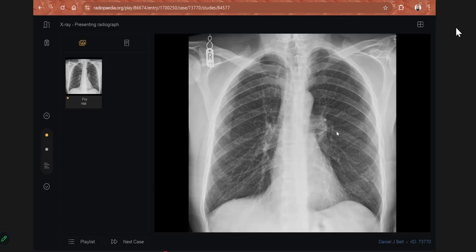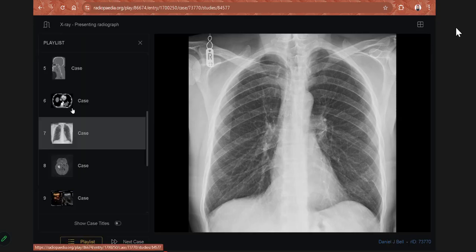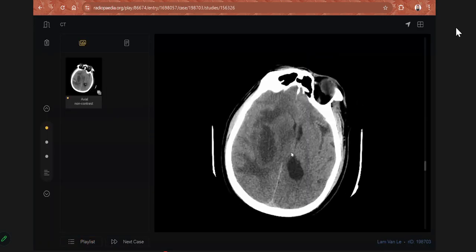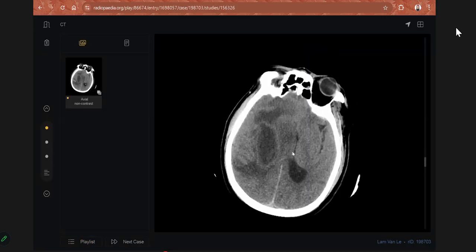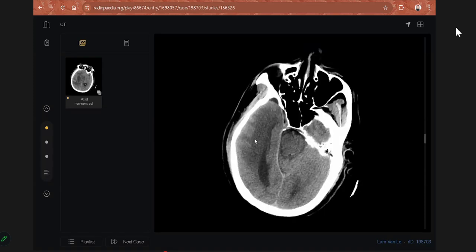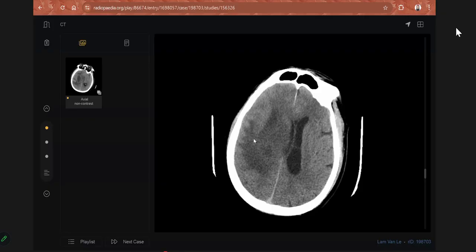So okay, fine. This case, on your next case, I gave you a CT plane. Try to focus on the plain study. Yeah, you described all the findings and saw there is a large mass lesion, along with gross edema.